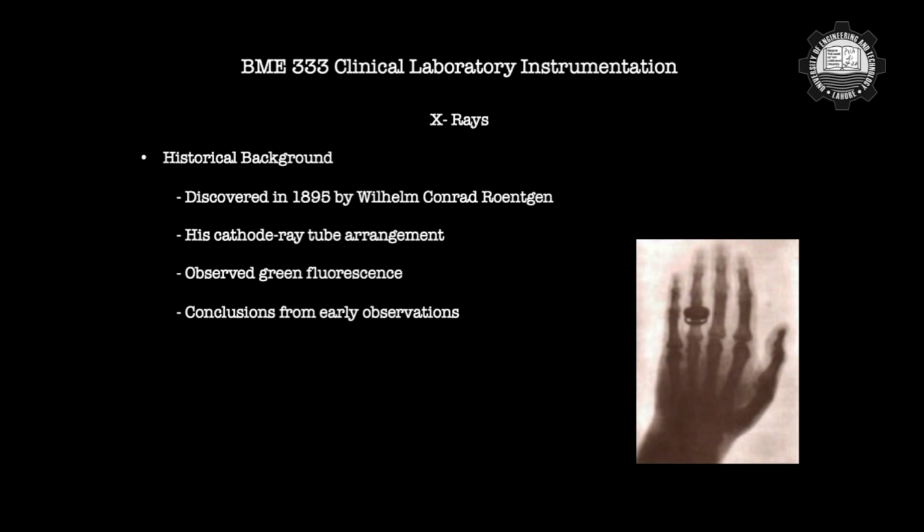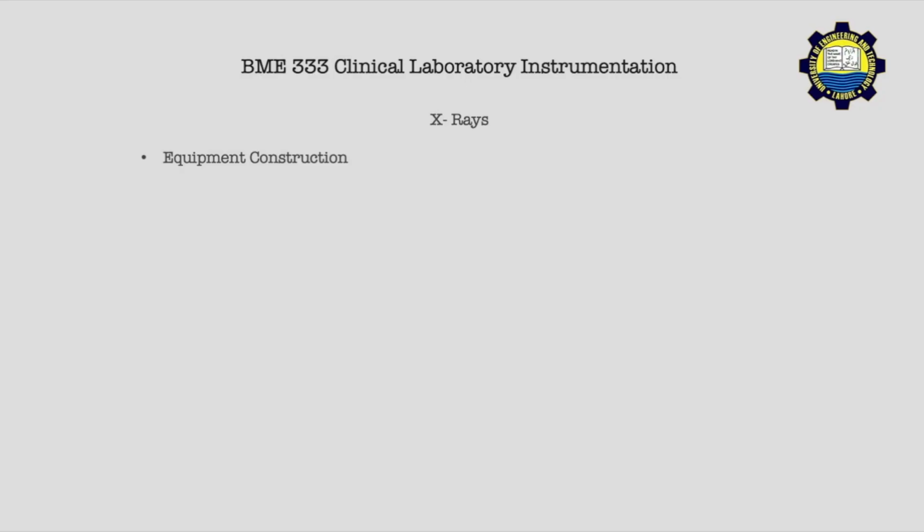So that was a groundbreaking medical innovation in terms of medical imaging, where the world witnessed some great novelty in research work, and that changed the course of medical imaging, especially in radiography. That being said, let's further shed some light on the construction of the X-ray tube. We've understood how it's more or less a glass bulb with electrodes in it, in a vacuum chamber. Well, let's look at it a bit more deeply.